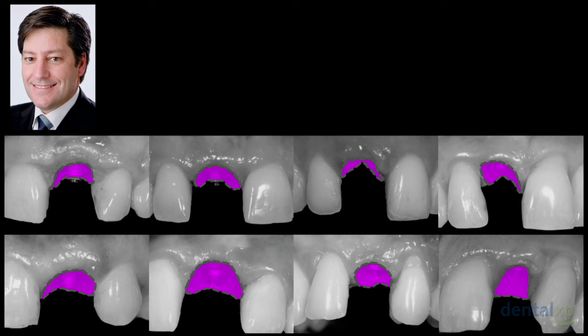Everything is done with the prosthesis. And I don't see how you can achieve that otherwise. Yes, you can customize a custom abutment, but ultimately, this is maintained and supported by the prosthesis. You can go 5 years down the road, take the prosthesis down, and the soft tissue will collapse in 2 seconds. This is how important it is.